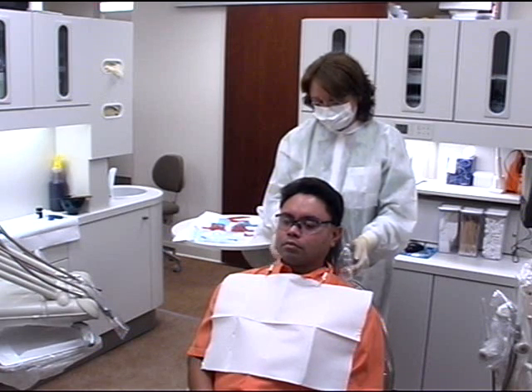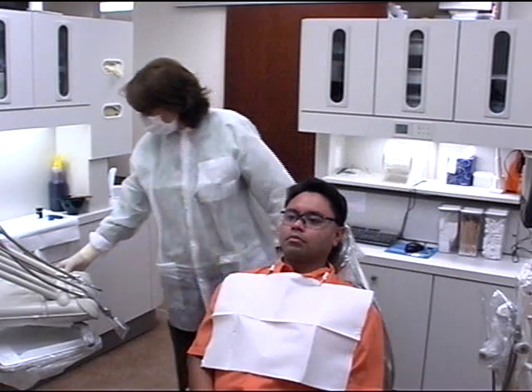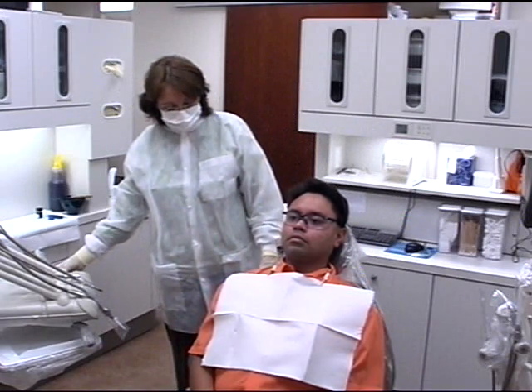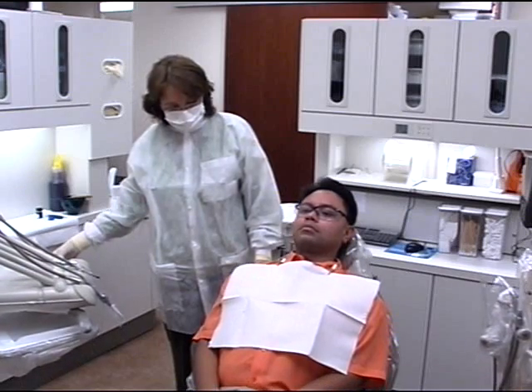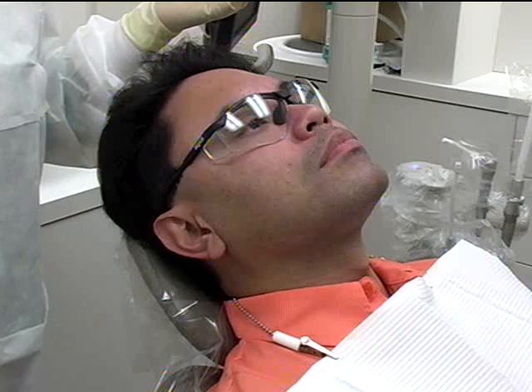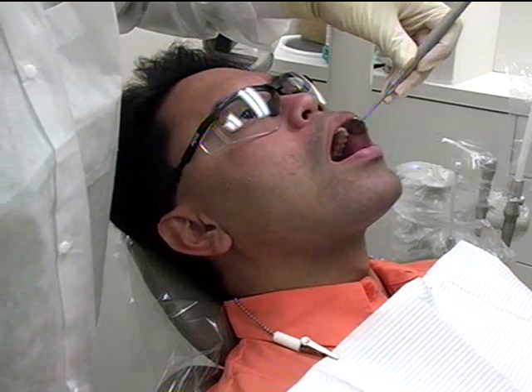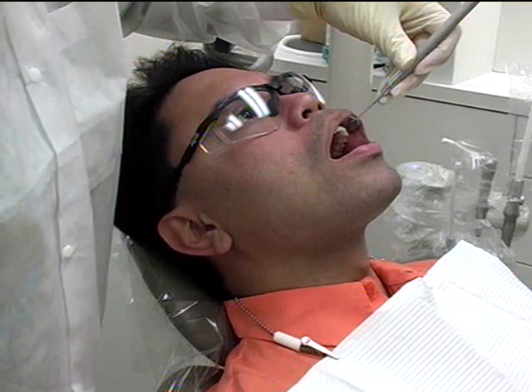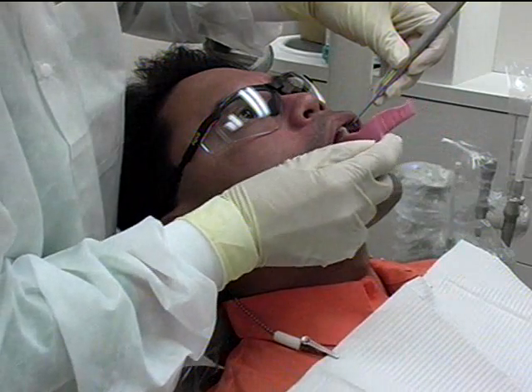Support the patient's head and maneuver the seat to a 45-degree angle at the elbow height of the operator. Using a mirror in the left hand, retract the patient's cheek. With the tray in the right hand, rotate and insert the tray.